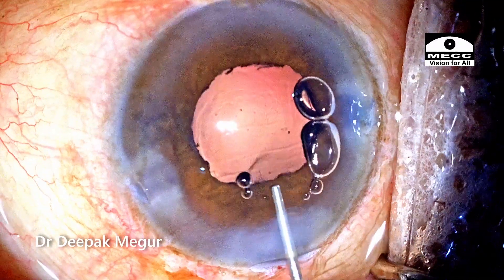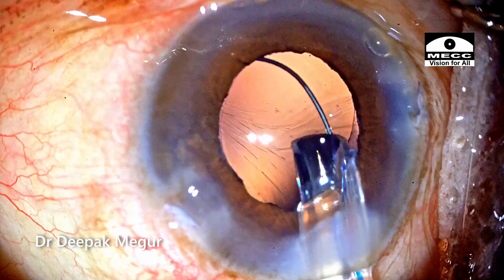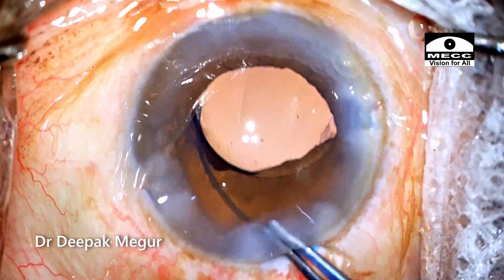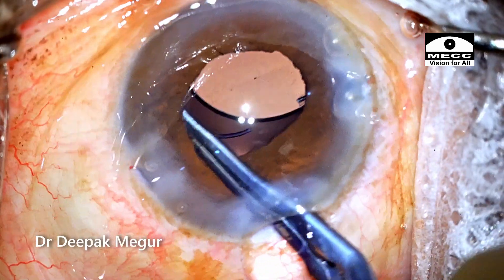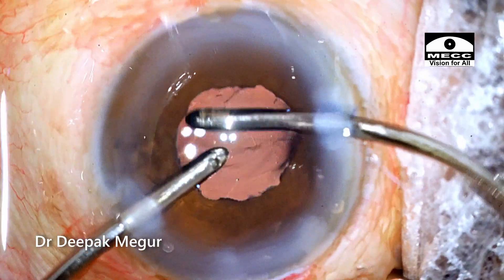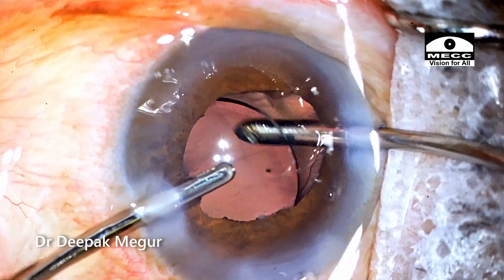I'm using cohesive OVD to form the capsular bag. A multi-piece lens is then implanted into the bag and the proximal haptic is maneuvered into the capsular bag. Time to remove the OVD. The cohesive OVD both in front and behind the lens is aspirated out.